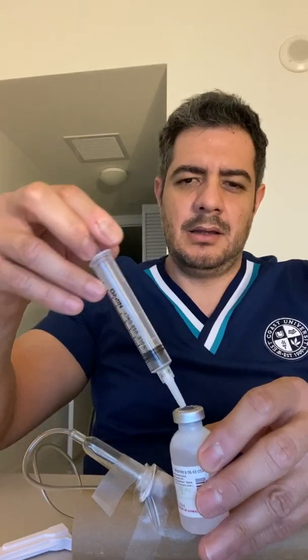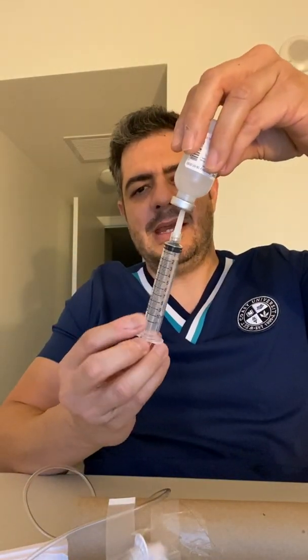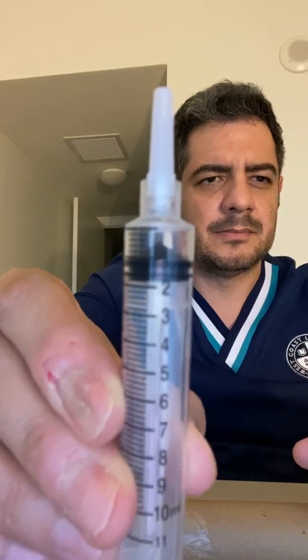Then, as we did before, we need to add 1 ml of air. What we do is we invert and we take 1 ml. It should be right there. So we can see it right here. I don't know if it's clear enough, but that's 1 ml. And we'll cover the needle with a safety device.